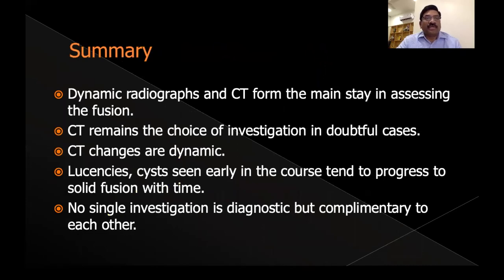To summarize, dynamic radiographs and CT scan are the mainstay in assessing fusion, but CT remains the investigation of choice in doubtful cases. And the CT changes are dynamic. The lucencies in the early course tend to progress into solid fusion with time. No single investigation is diagnostic, but they are complementary to each other. Thank you very much for your kind attention.